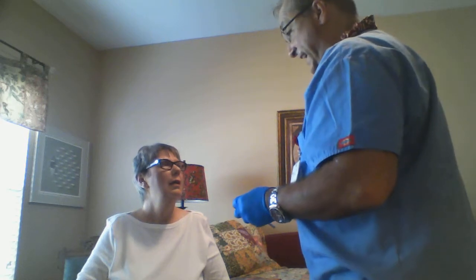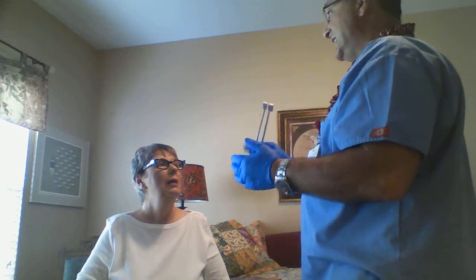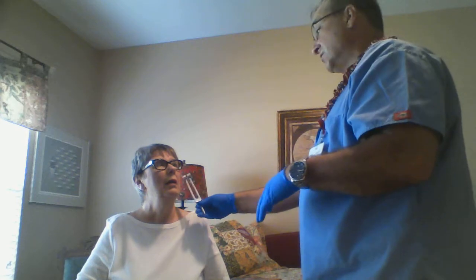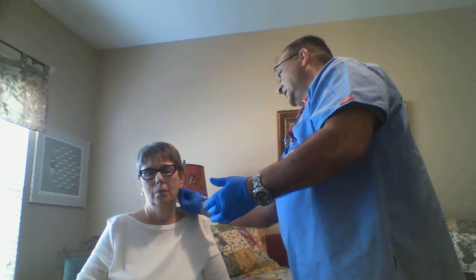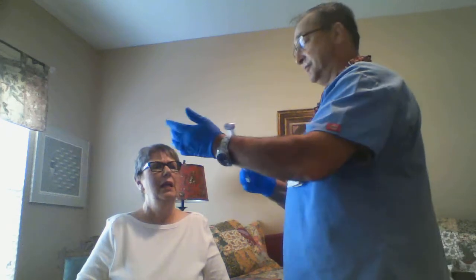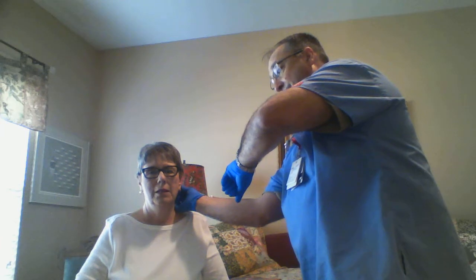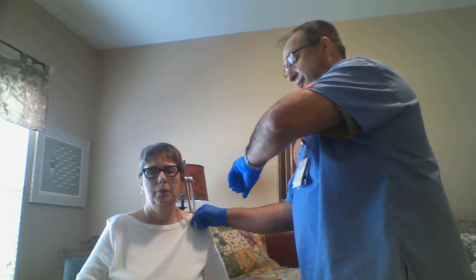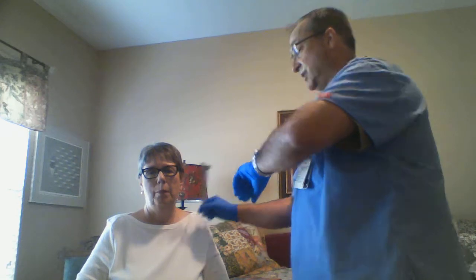All right. Next thing we're going to do is called the Rinne test. What's going to happen is I'm going to strike it and put it on the bone behind your ear, and you're going to hear it. When you stop hearing it, I want you to tell me, and then I'm going to place it right next to your ear, and I want you to tell me when you stop hearing it. Okay. I'm not hearing it. You're not? Let's try that again. Okay. Stop. Stop. Okay. So your AC was a little longer than your BC, which is what we want. Okay. And then we're going to do the other side.